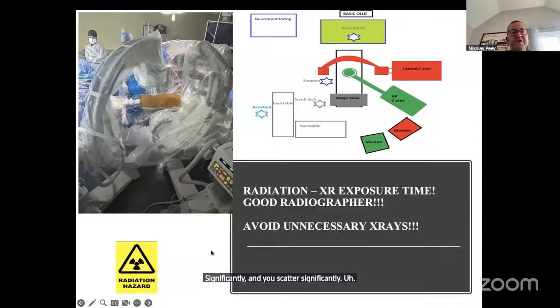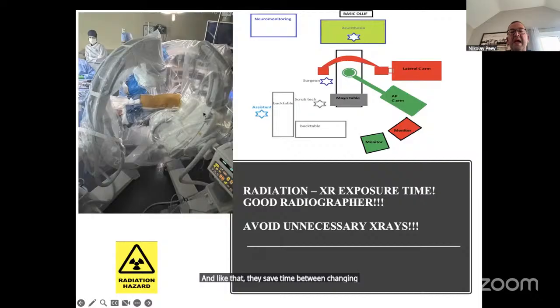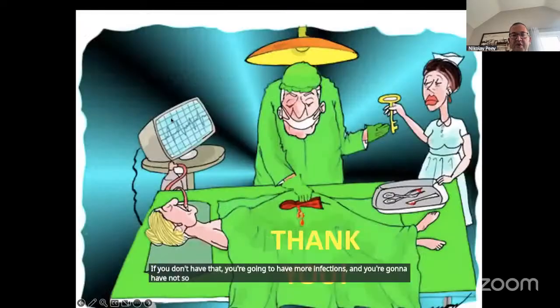Some people prefer to use 2 X-rays when they do these minimally invasive techniques, and like that they save time between changing AP and lateral. However, that leaves you less space to manipulate instruments. Also, sterility could be a problem. You can just imagine that this surgeon has good sleeves here and everything is nicely draped. If you don't have that, you're going to have more infections, and you're going to have not so much space to work. And thank you.